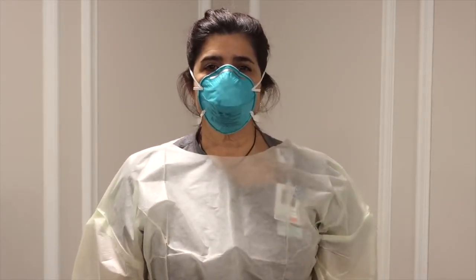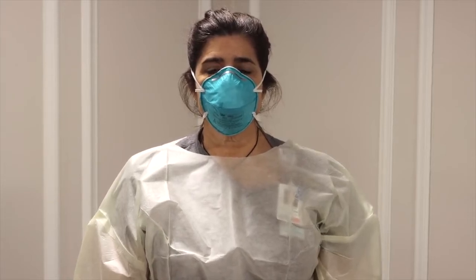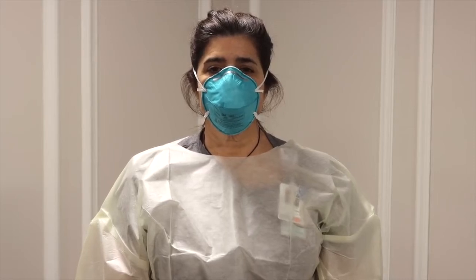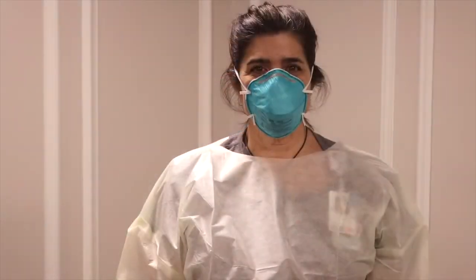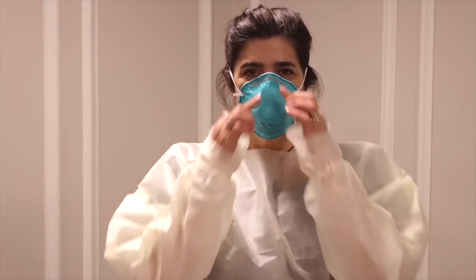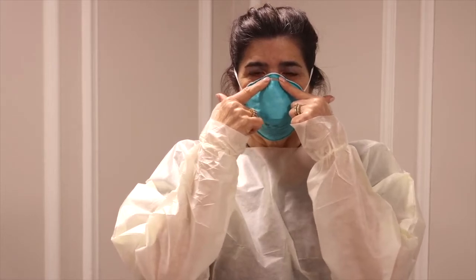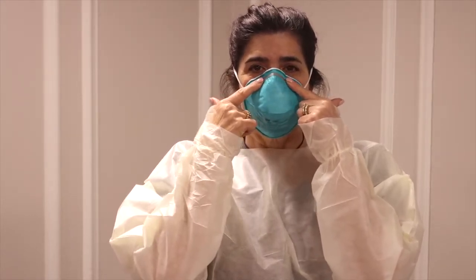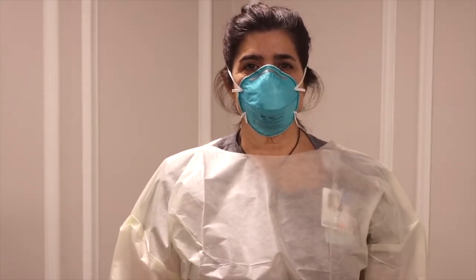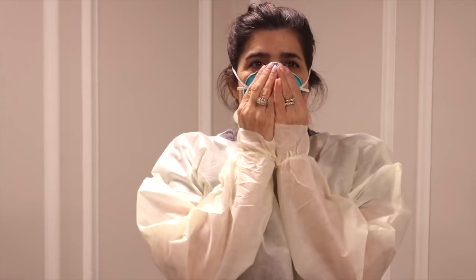A user seal check is sometimes referred to as a fit check. As a reminder, a user seal check should be completed each time the respirator is donned. If the seal check is unsuccessful, common failure points are the nose piece. Readjust the respirator and re-smooth the nose piece over the nose, avoiding pinching and creating a gap. Then re-perform the seal check to ensure a proper fit.